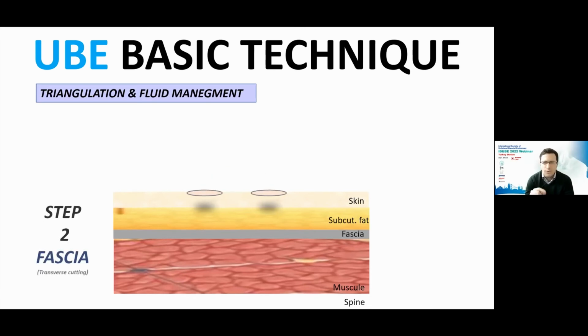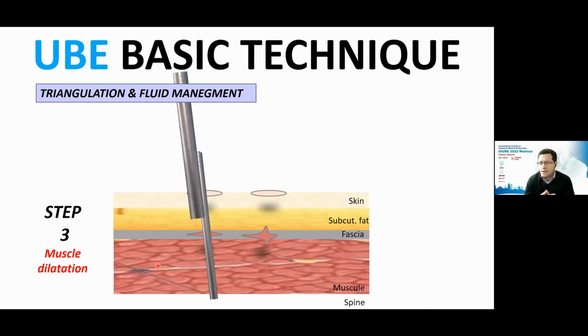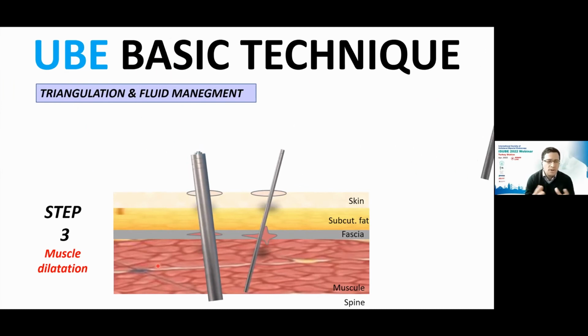But you need to understand that you not only open the skin, you have to open the fascia very nicely. The fascia needs to be opened not only longitudinally but also in a transverse way, because this is your soft portal that is going to restrict part of the surgery. After these 2 incisions, you need to use the dilator. In the endoscopic portal we usually do not use one, and in the working portal usually 2 or 3 dilators to open our fascia and keep our port open.